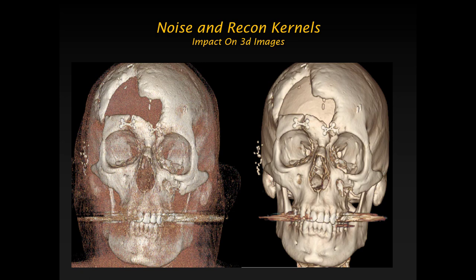In this example, we have a surgeon that wants to know, well, what does the skull look like? Is the swelling going down? How am I going to map this out? How am I going to put the rest of the skull back together now that we're done with the swelling? So this is a really good example of when you want less noise. So for 3D reconstructions, MIPs, generally speaking, you want lower noise values.